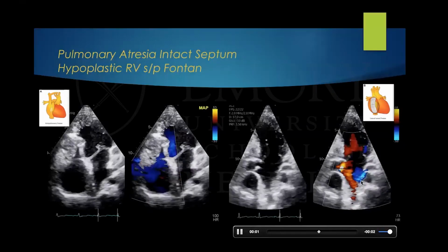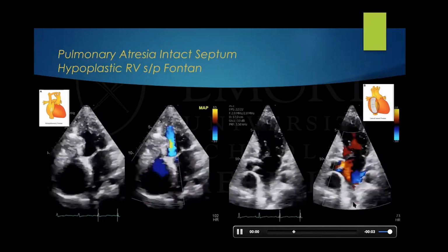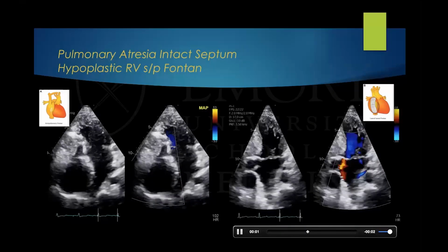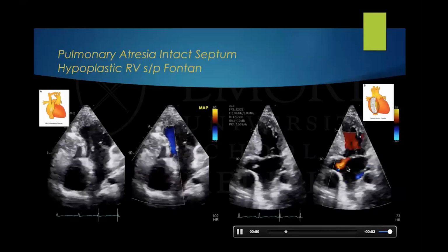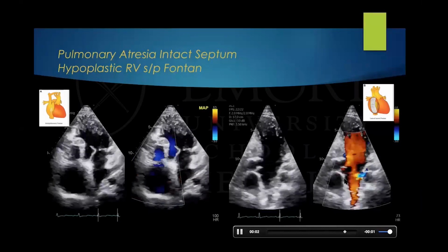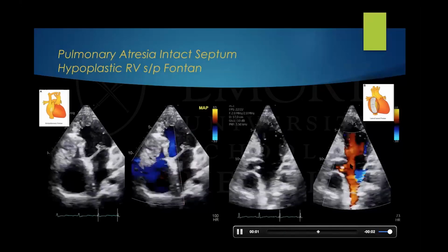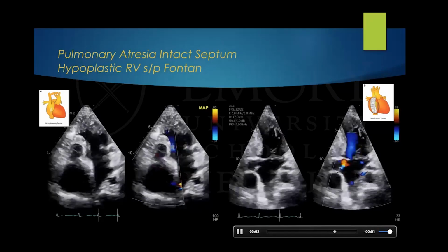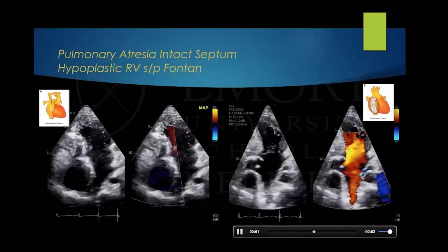This blue flow here is a left pulmonary vein. This red is the right lower pulmonary vein. There's a little bit of mitral regurgitation, and this left ventricle is functioning normally. They also remove the septum, and that's to allow the coronary sinus flow that is coming back into the right atrium to drain back into the left and out to the LV and the aorta.